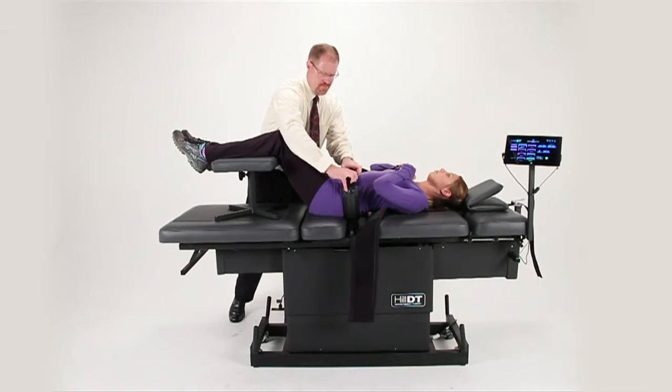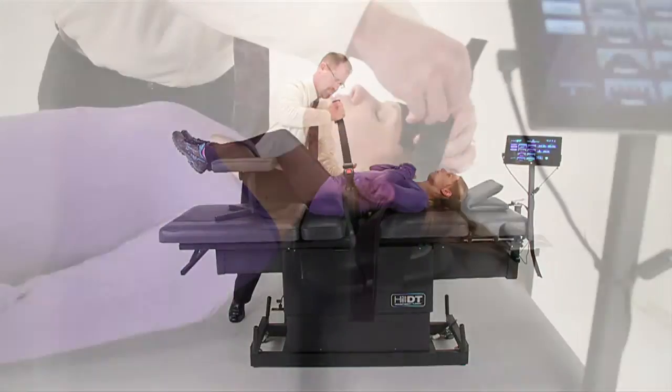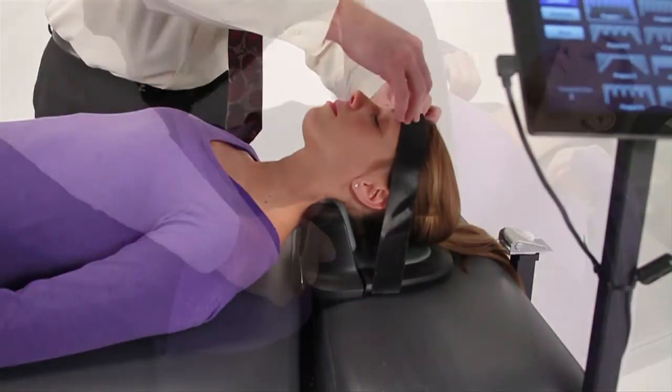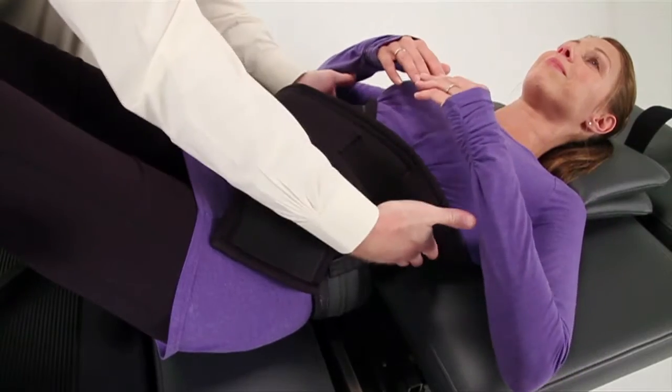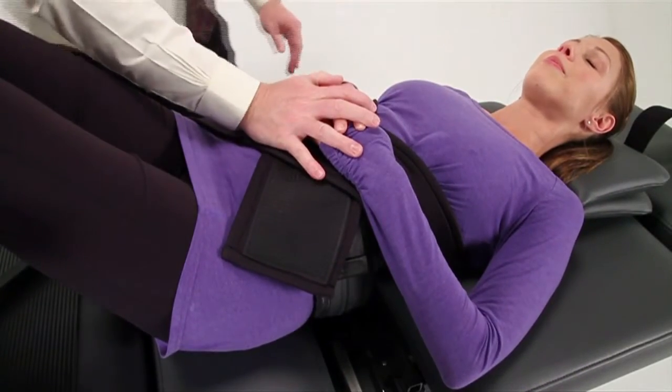Patient setup on the Hill DT is faster and better than any other decompression table. A fast, secure patient setup makes for a happy staff and a relaxed atmosphere that's more conducive for effective patient treatment.